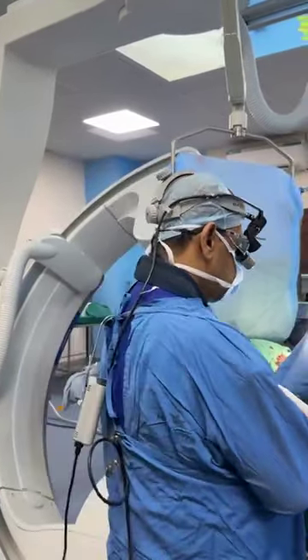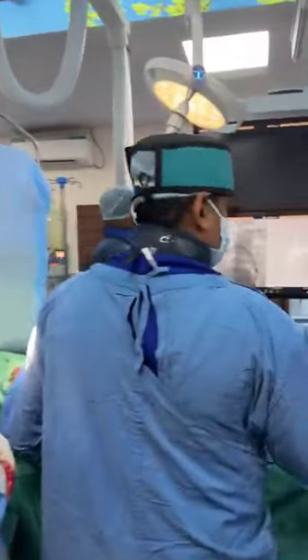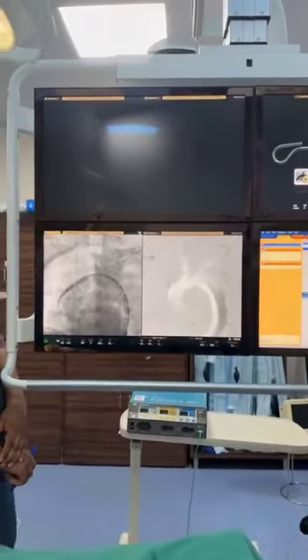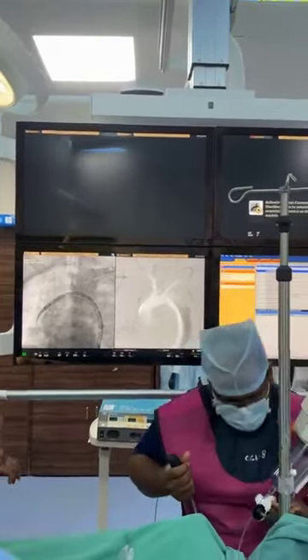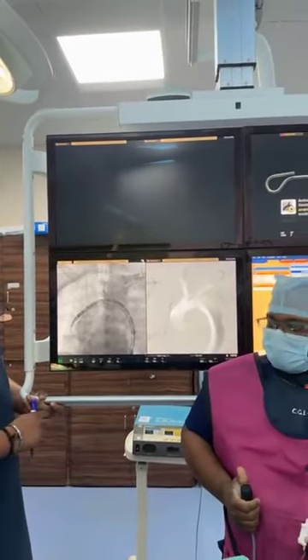Okay, beta. So we are ready to go ahead with an angiogram. Prashant, beta. I'll request for an apnea, Dr. Prashant. Okay. Apnea, please.